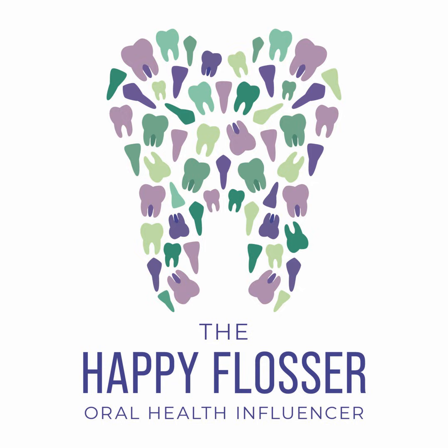One of the other little tips that you can do is have the patient smile when you're looking through the ring. This will help you see the teeth and see which teeth will show up on the image. It's a really easy trick to do. Now, there are some other challenges that occur with patients that have tori or a sensitive gag reflex. Being confident in what you're doing goes a long way at helping you manage those patients. And patient management is something that just comes with experience and time.